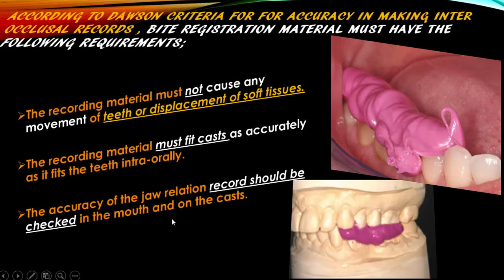مثل ما نشوف material هذه الصور. This is the material used مثل ما قلنا. طبعا displacement يعتمد على consistency of the material. شو ما تكون الماتيريال soft displacement يكون قليل.